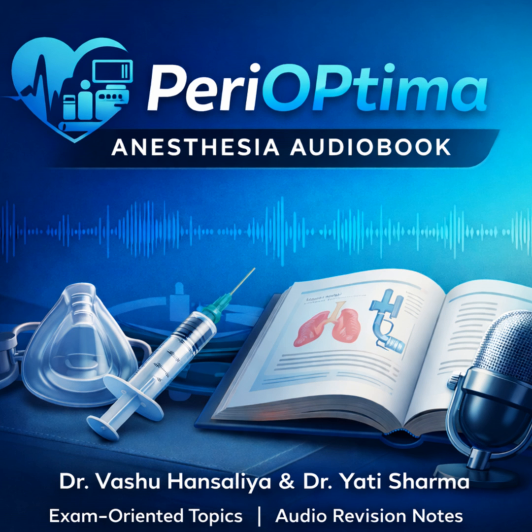And then, for a cuff device, the crucial next step is inflation. Yes. You inflate the cuff with the recommended volume, but critically, you have to watch the device. It should rise slightly as it settles into the correct hypopharyngeal position. Excessive volume, however, risks increasing the cuff pressure above the therapeutic range, and that can lead to complications.